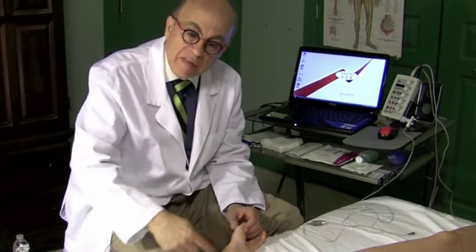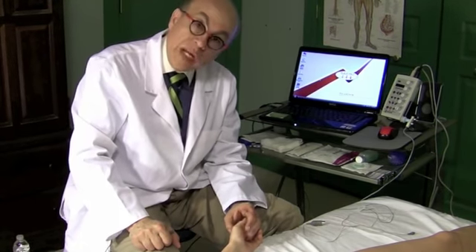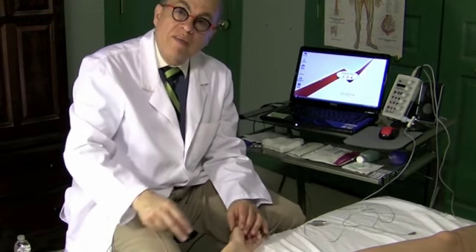If they are both abnormal, the patient either has a median nerve problem and an ulnar nerve problem, or, more likely, they have a C8-T1 root lesion at the back of the neck. So basically, what I'm trying to do here is study muscles that come from different nerves but from the same place in the neck, or from the same nerve and different places in the neck.